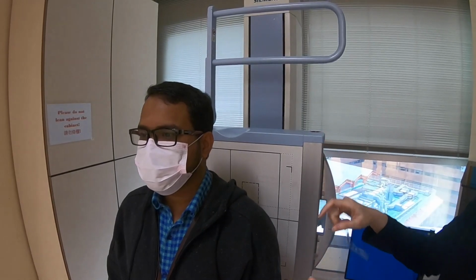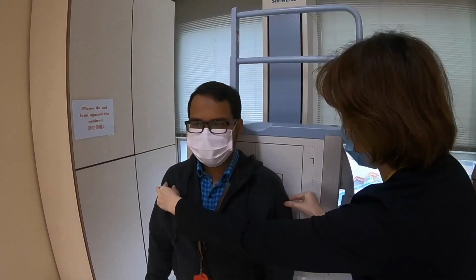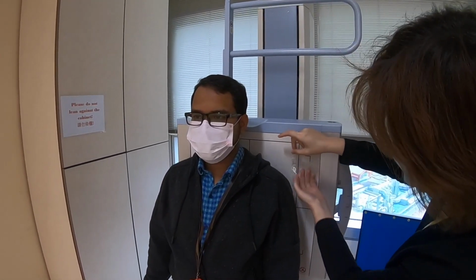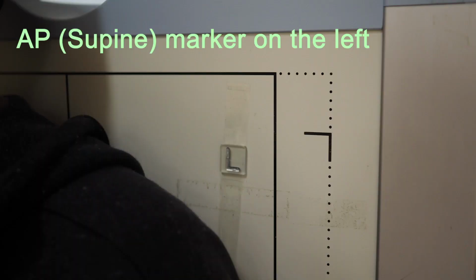To take an AP projection for him, we are again going to use a supine marker. So this time maybe we are going to demonstrate an AP shoulder for him. Again, if we are going to take the left shoulder for him, we need to use a left marker with a supine orientation. So please be aware of the difference between AP supine and PA, and use these markers in an appropriate orientation.